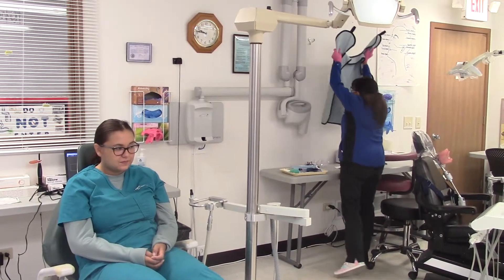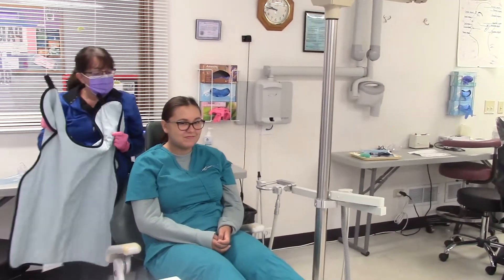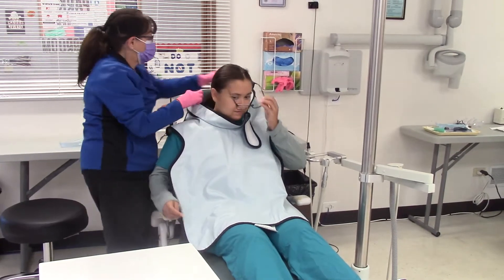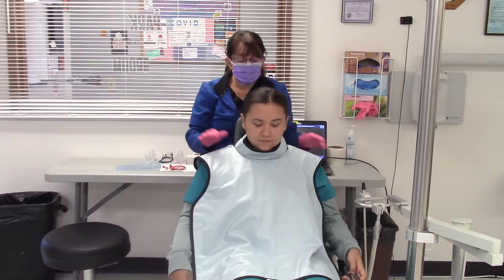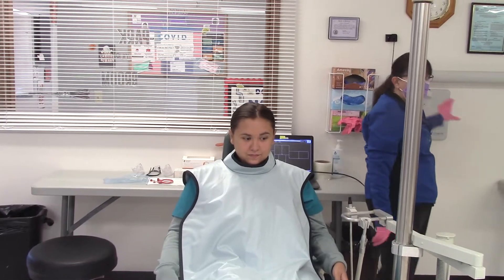This is our patient. Could you take the glasses off? We want to make sure that the lead apron is secured by the thyroid collar and that it is covering her.